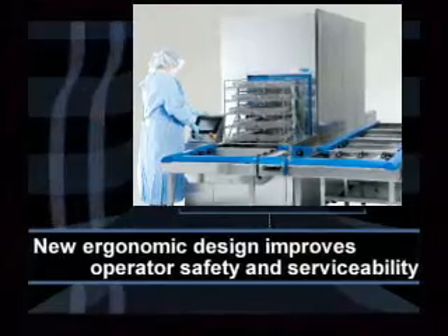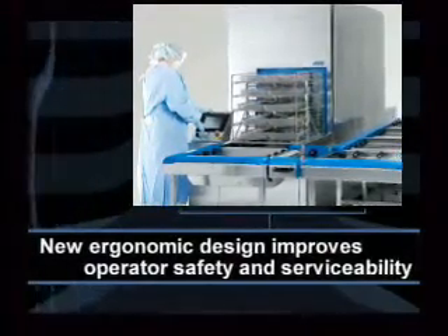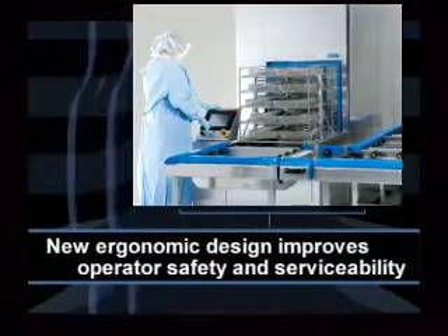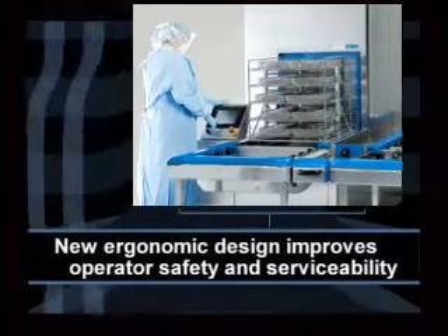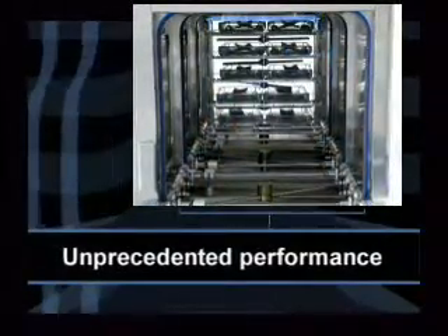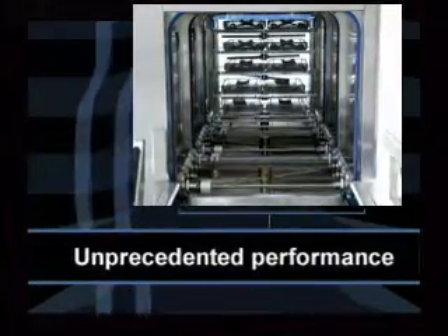The Vision is ergonomically designed to enhance operator safety and is manufactured for optimal reliability and easy component access, improving serviceability by providing one-sided service access. The lowered load height makes the operator interface safe and easy. This automated multi-chamber system provides a larger capacity for maximum throughput and a comprehensive process with unprecedented performance.